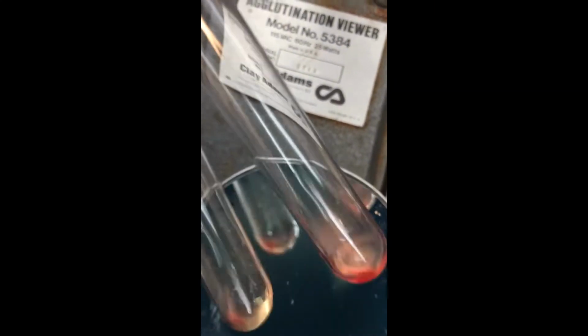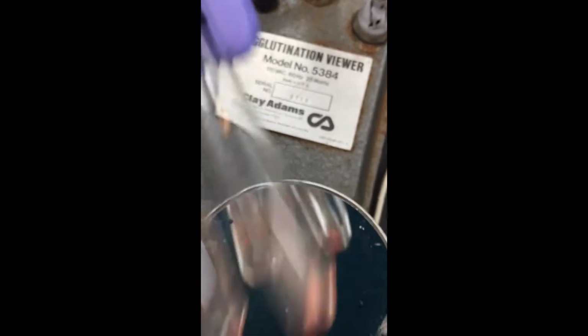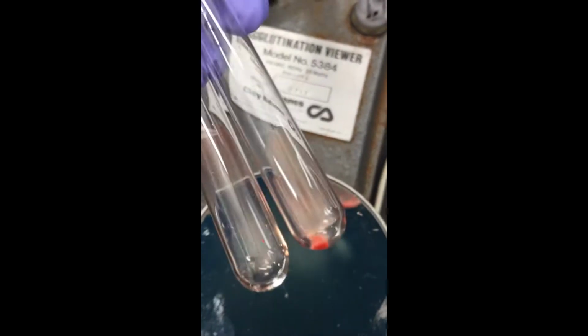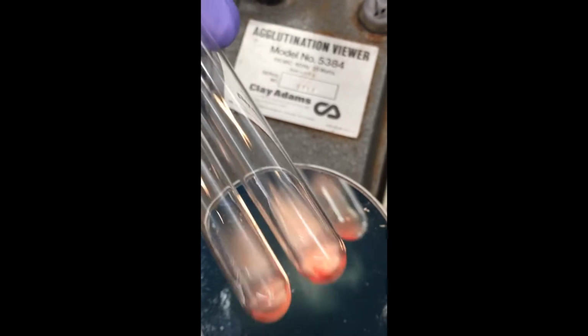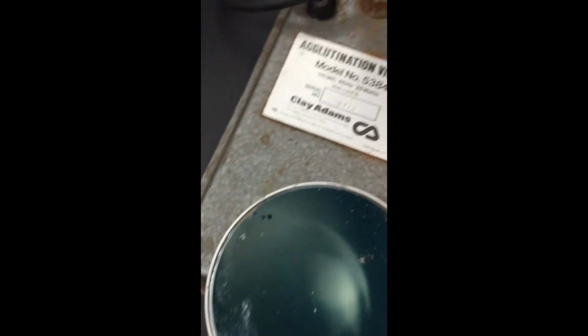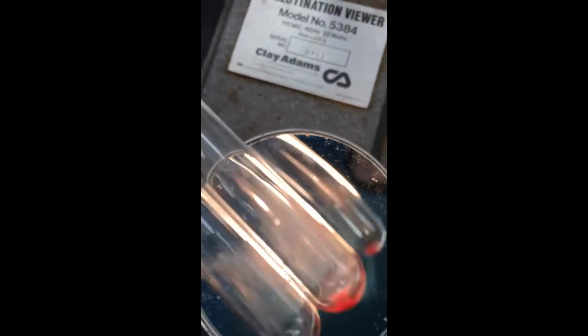All right, so I have immediate spins, and we'll let you see. This is sample C, tubes 1 and 2, immediate spin. Tube 1 is on the bottom or the left. Tube 2 on the right. Tube 3 and 4, sample C.